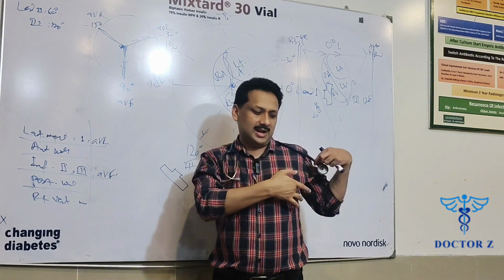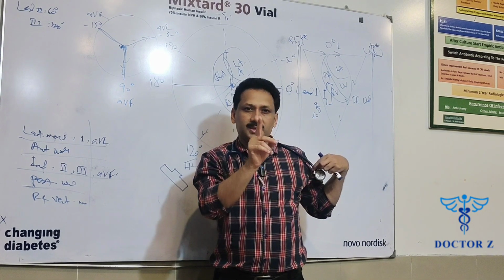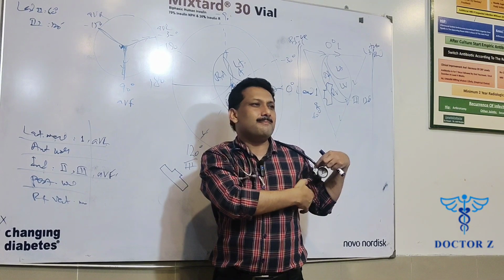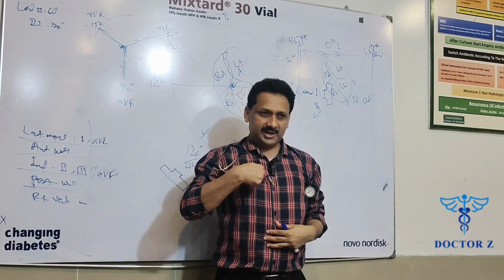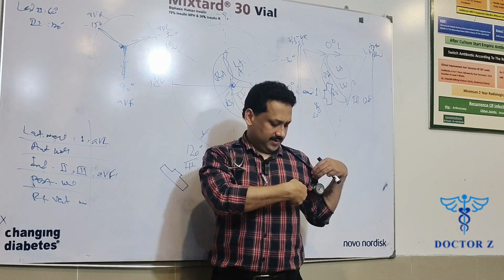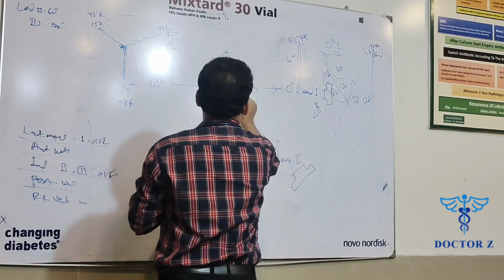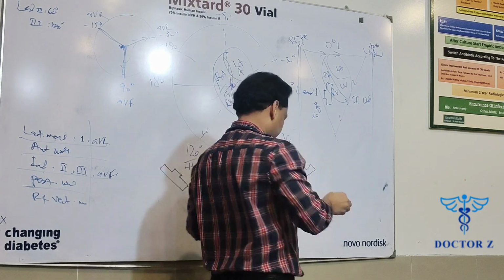Then you will be placing lead V5 on the anterior axillary line, in the fifth intercostal space. Then you would be placing the final lead in the mid axillary line, that is V6. So again, fourth intercostal space, right sternal side, V1, V2, V3, V4, V5, V6. So this is how we will be placing V1 to V6.